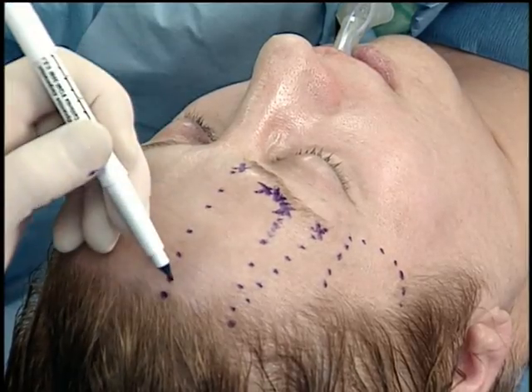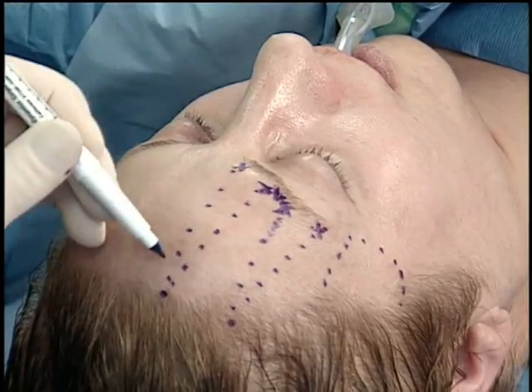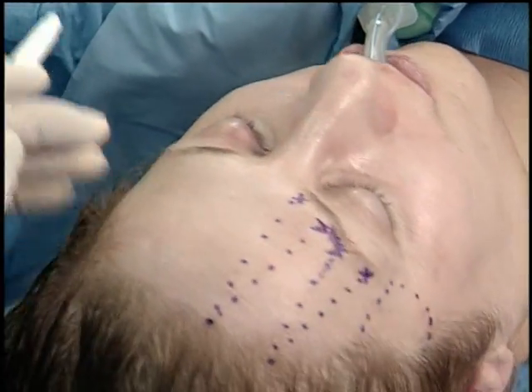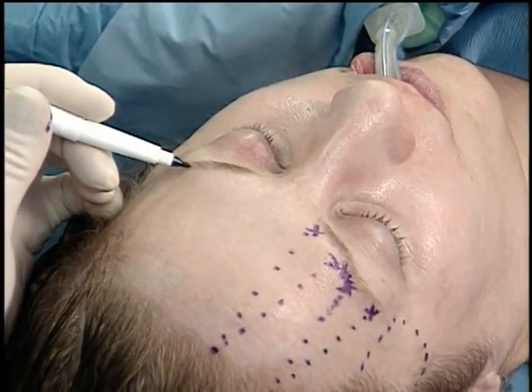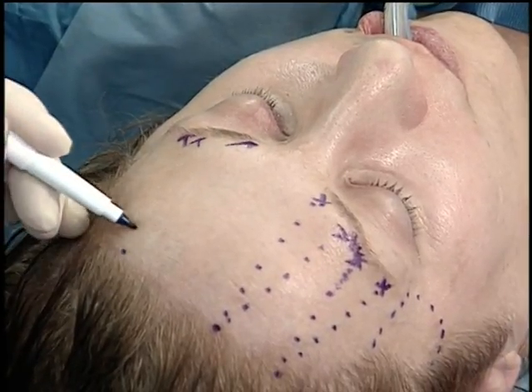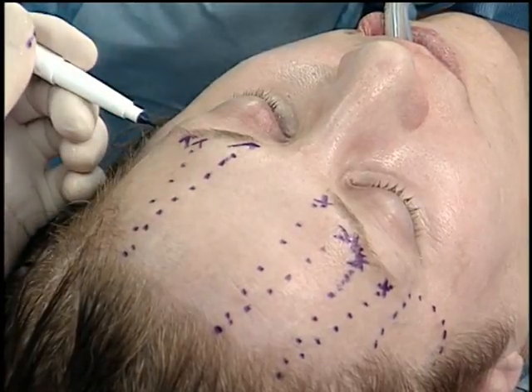And there's our second contour articulus thread. So we have two loops, two loop lifts, one medial and one lateral to elevate the brow. And we would do the same on the contralateral side to match the lift on the other side as well. There's our neurovascular bundle. There's our exit points, deployment port, and anchor port, and trajectory.